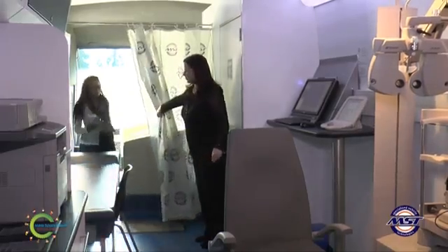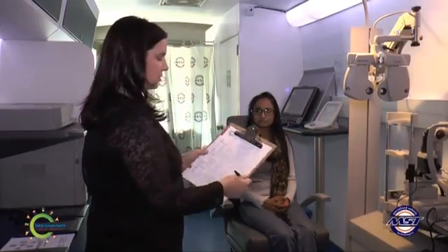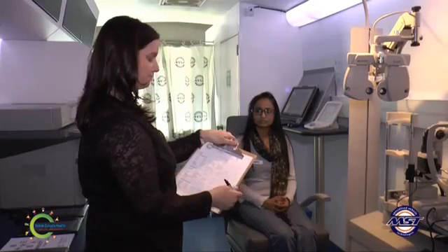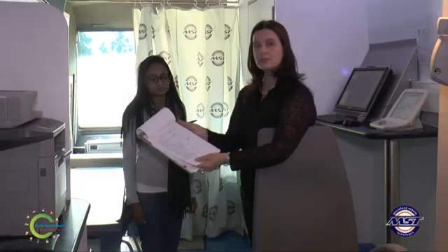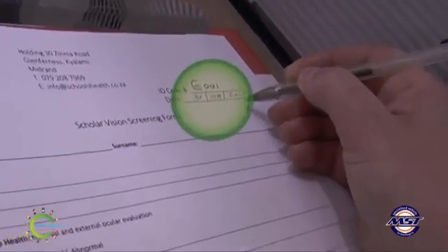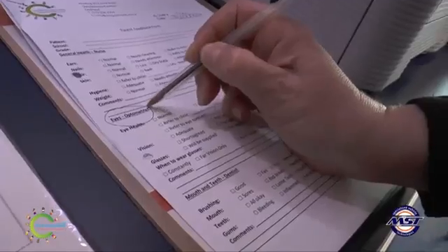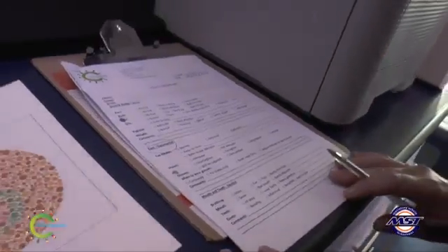Once the patient arrives at your station, having been pre-registered outside, check that he or she has the parent feedback form which will be completed at each station. On all equipment used, we will use the same unique patient ID code. Double check the patient's unique ID code and fill it in at the top of the parent feedback form.